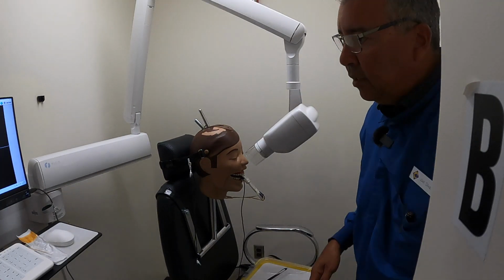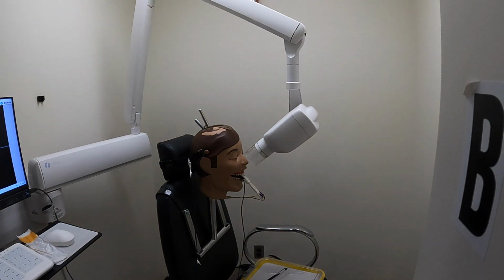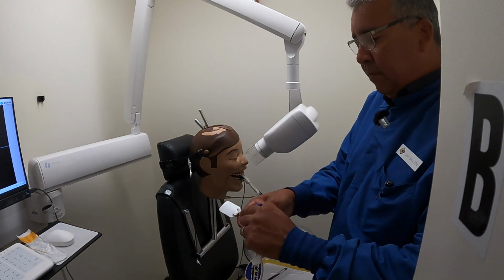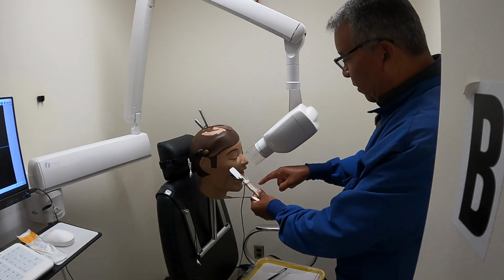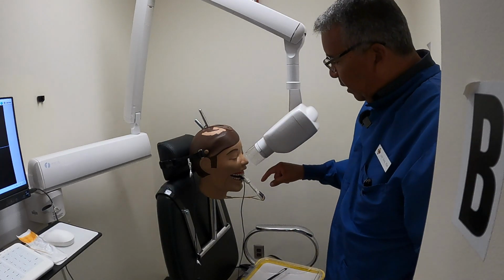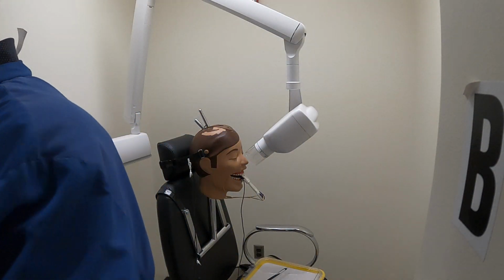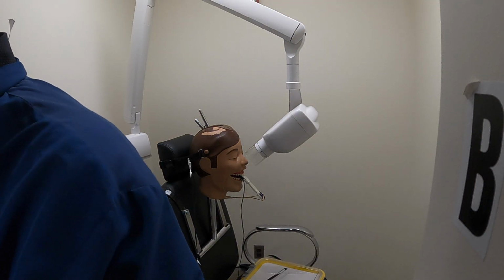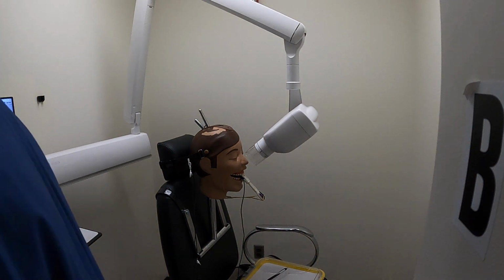Now, here's the other thing I want to go over. The other subtle difference is this. Your reference point, you no longer have this little tiny angle on there to cover your sensor. That little thing is not on here. So your new reference point for this snap array is the word RINN, right there. On that one, you want the PID to come halfway through that whole word. That'll put you in pretty good line with covering your sensor.